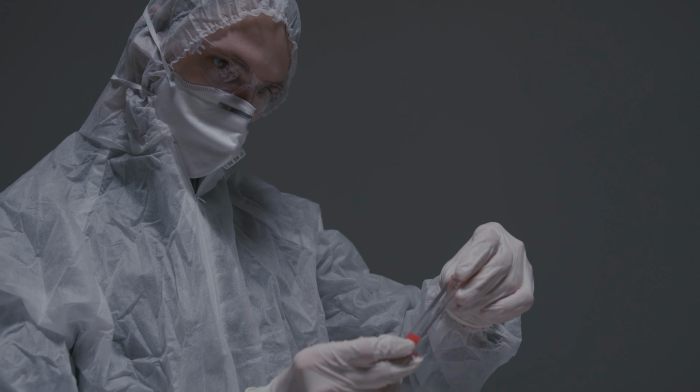These catheters or devices are indicated for total parenteral nutrition, blood administration, intermittent or continuous medication administration, especially long-term antibiotics, vesicant agents, or chemotherapy, multiple blood draws, parenteral fluids, and long-term venous access. Central venous access devices are beneficial for patients who receive IV therapies that require the hemodilution from the blood flow in large central veins. What are the safety risks when using a central venous access?